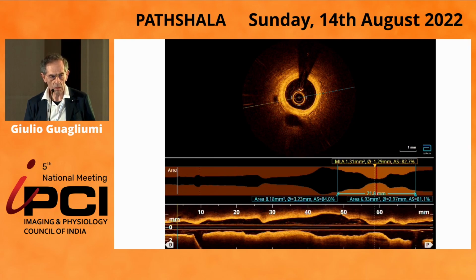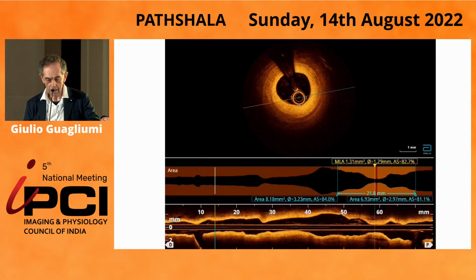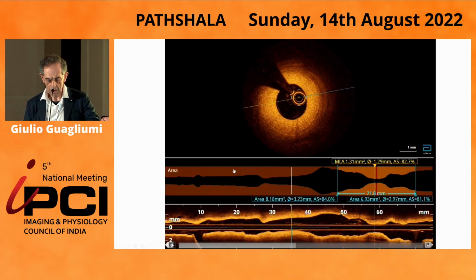The original right coronary artery was occluded, and there were 2 segments of the angio with very high significant stenosis, one more focal proximal and one more distal uniform. This is the original posterior descending artery. Then we are going to get the bifurcation of the right, and then we are entering the radial graft. Here you can see the distal portion. I'm trying to move back to this zone with an incredible neointimal proliferation. This was the mid-distal part of the radial graft.